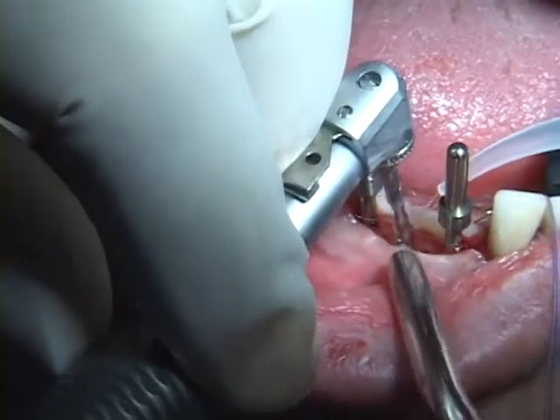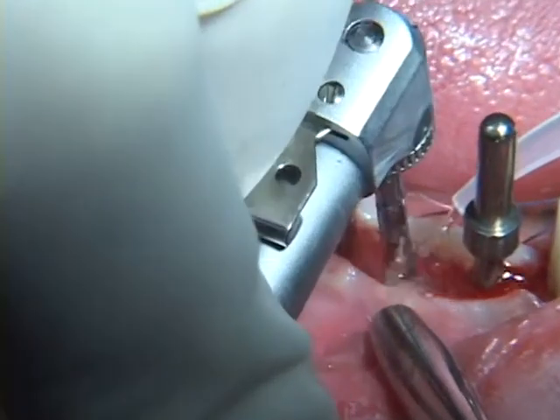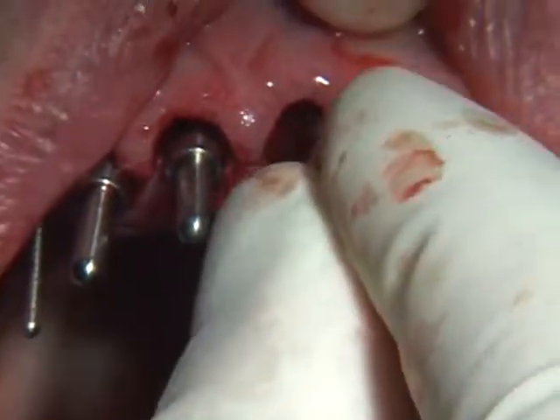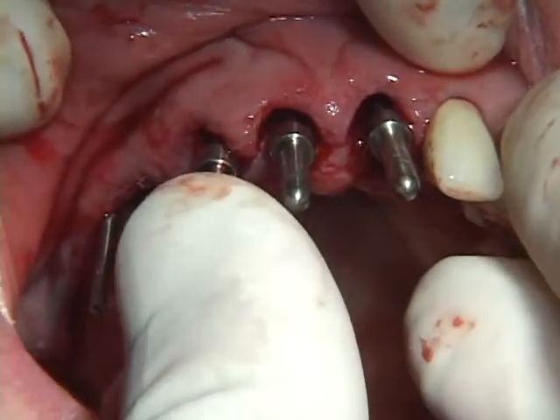If multiple implants are being placed, paralleling pins should be inserted consecutively into the completed pilot osteotomies to facilitate establishing the trajectory of the pilot drill for the preparation of subsequent osteotomies.